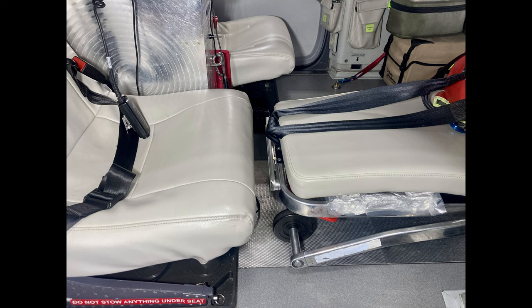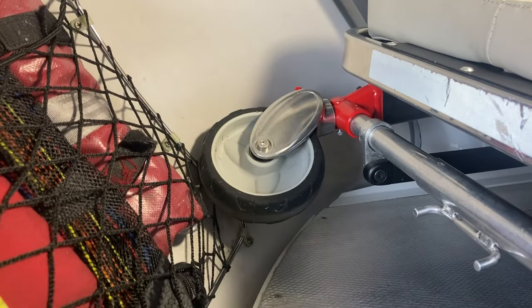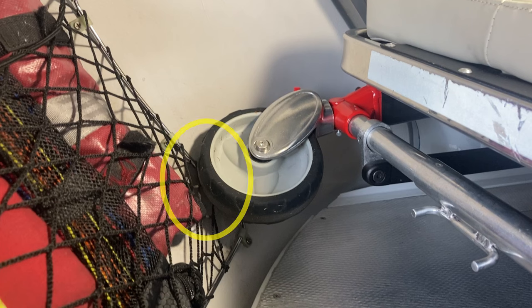One thing crew members will notice is that there's really no leg room, so you can't put your legs where you used to. You'll have to put your legs a little to the side of the head of the stretcher. Also be aware that the clamshell door hits the back left wheel of the stretcher — just a little bit, but eventually it will wear out the cargo net back there.